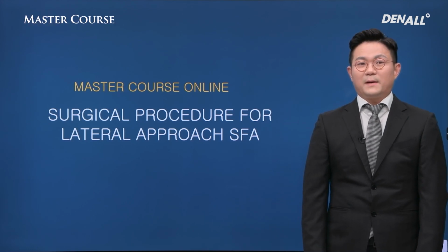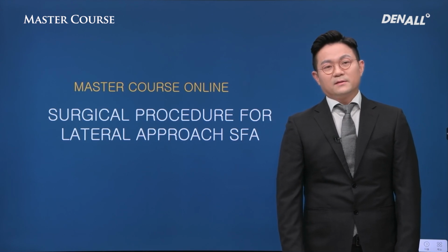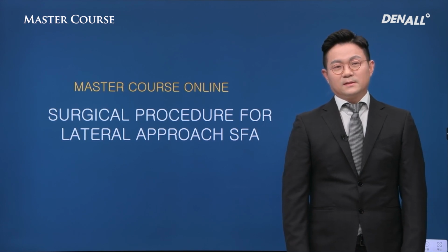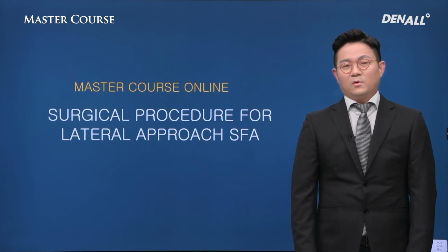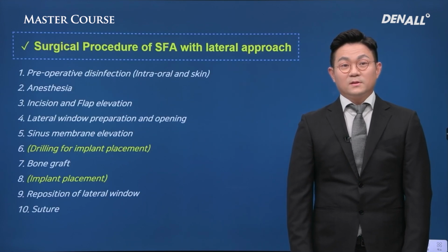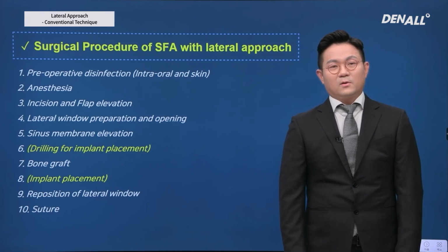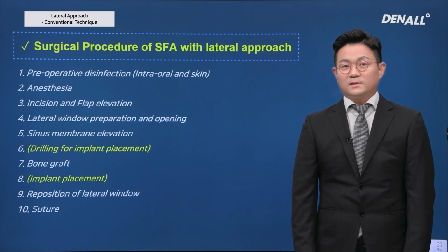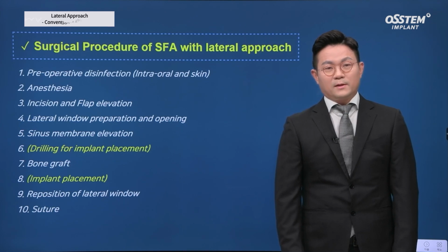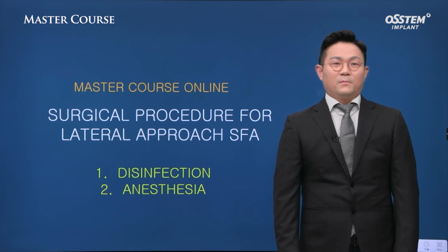As you know, lateral approach is the most common way for doing sinus surgery, and sometimes it's the only way to do surgery. So I have to cover this in a limited time. From incision to suturing, I'm going to go through them step by step. Before operation, you have to disinfect and do anesthesia, and you end with suturing. I'm going to focus on the important steps and just give you a high-level overview.